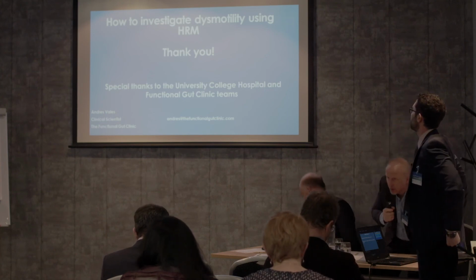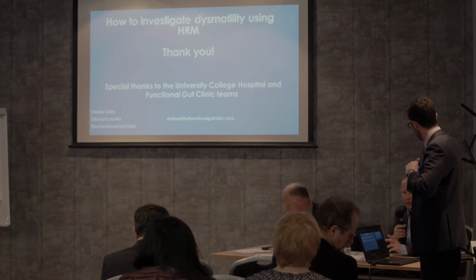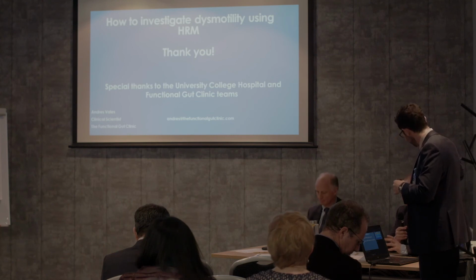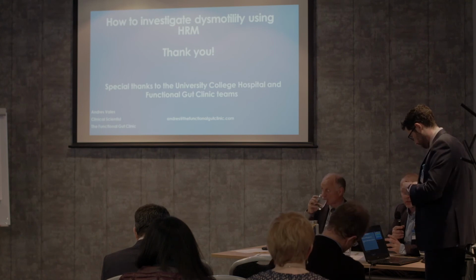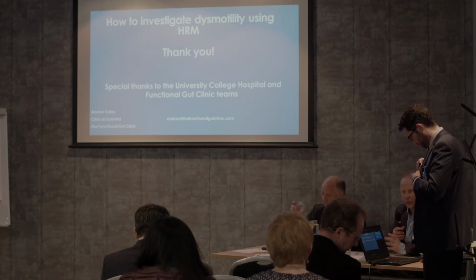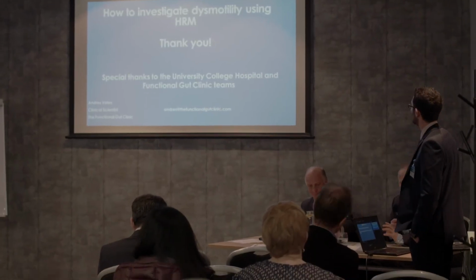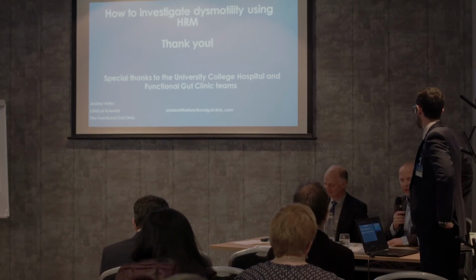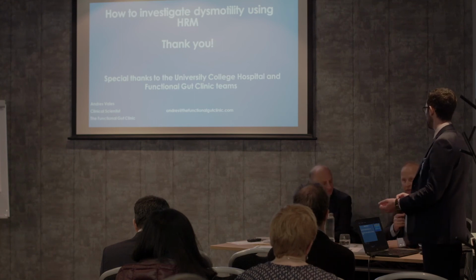Thank you very much, Andres. Just before I open the floor to questions, I'll complement Andres' talk with a few points, because I appreciate there are some experienced people here, but there are probably some people who are fresh to it or have just recently started. When we're talking about the Chicago classification, we have to bear in mind these are for patients who've had no intervention. So there's no point saying there's a raised IRP, the integrated relaxation pressure, if they've had a fundoplication, because that's normal. That's the whole point of having a fundoplication, to create that residual pressure.